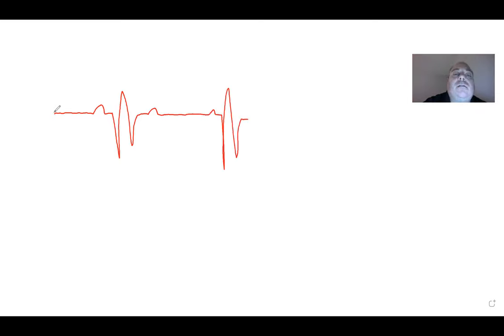All right, so that's a PAC. Okay, now sometimes, and this gets a little tricky, guys. I'm sorry, life's tough, you know. You get something that looks like this, and that's a T wave, and then you get something like that. Suspense is building, I know. Oops, I messed it up. I made you wait all that time for nothing.